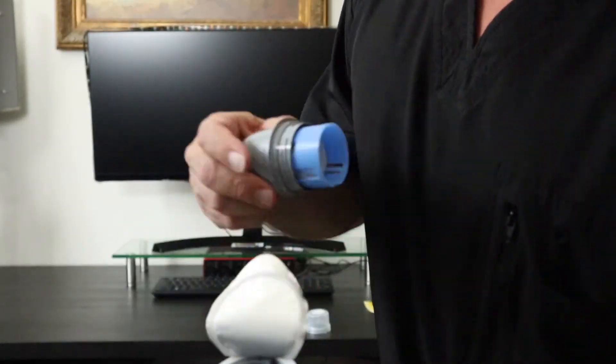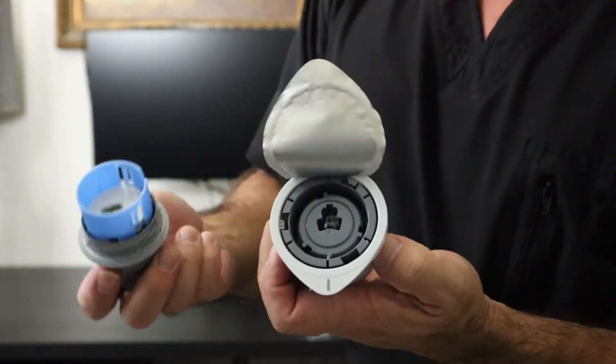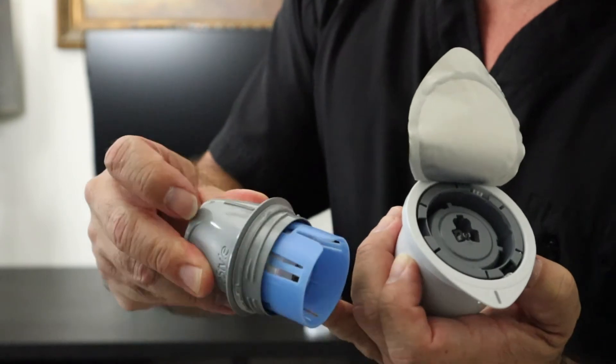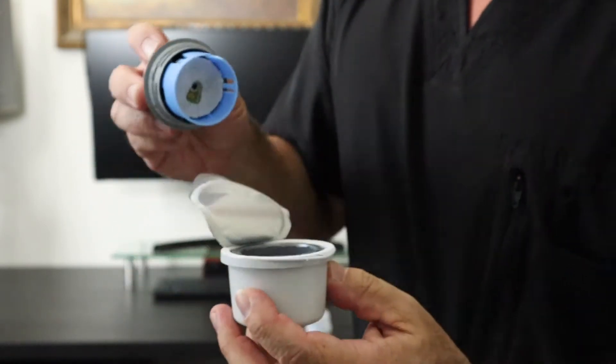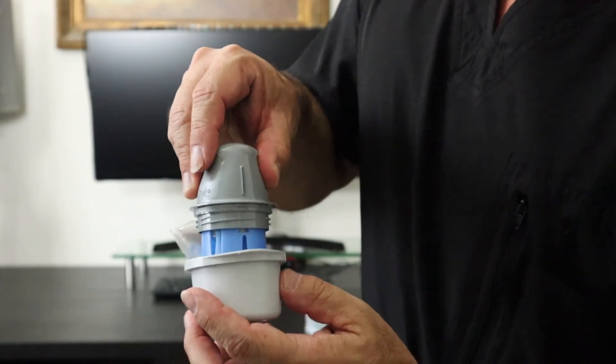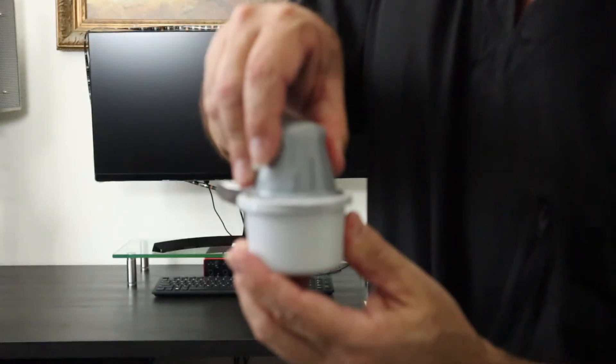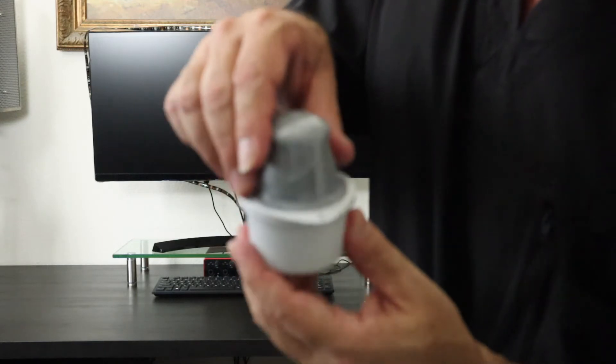What we're going to do is line up this line here with this line here, and then we're going to put this in here. Click. And then when I pull it out, it's all ready to put in my arm.